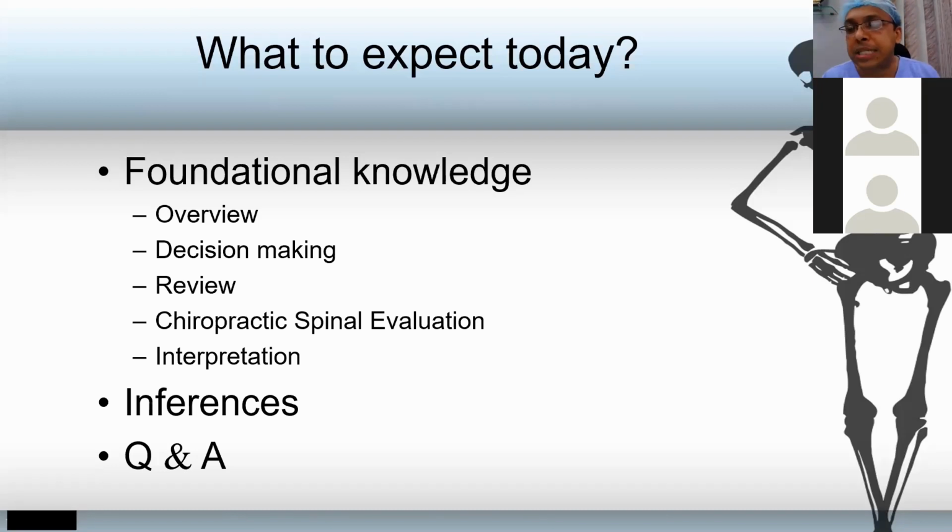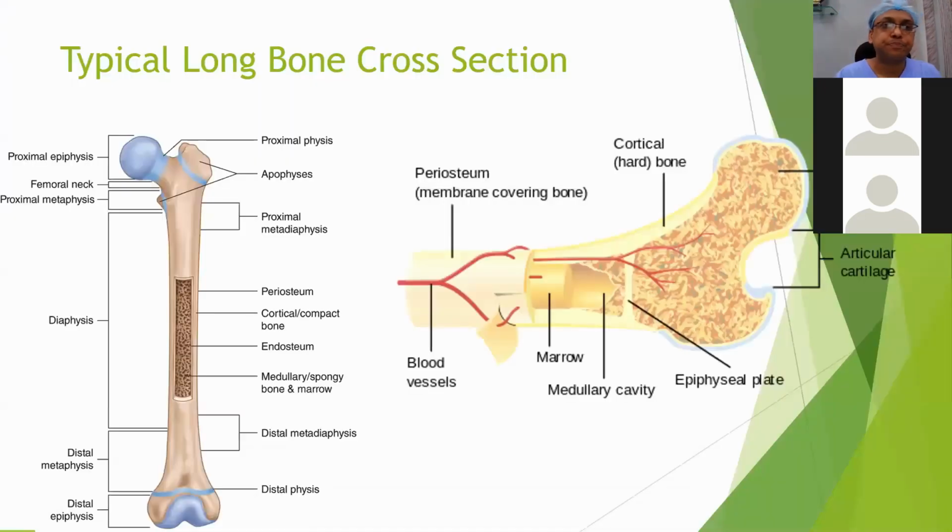Then we'll try to interpret certain joints between normal and pathological. We'll make certain inferences from those X-rays. And at the end, the question and answer session is for you to ask me questions, and hopefully I can satisfy you to the best of my abilities.